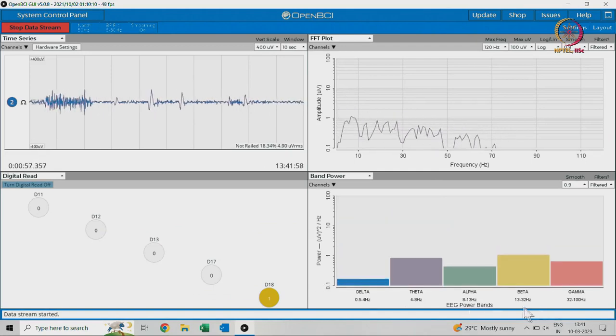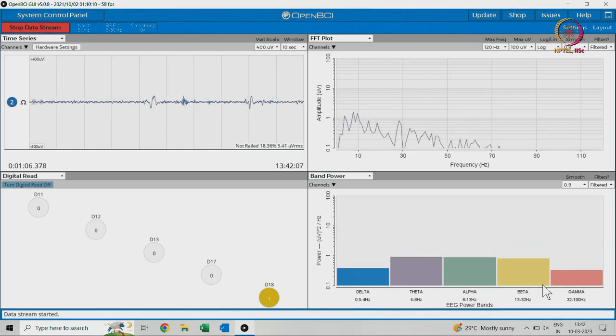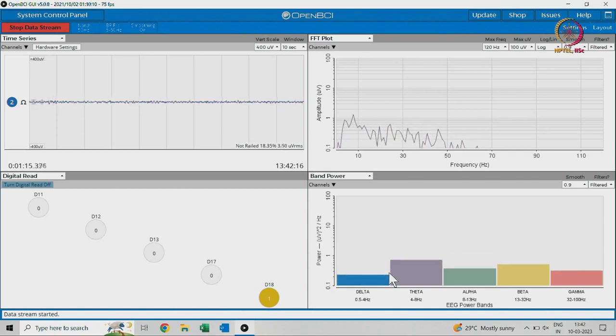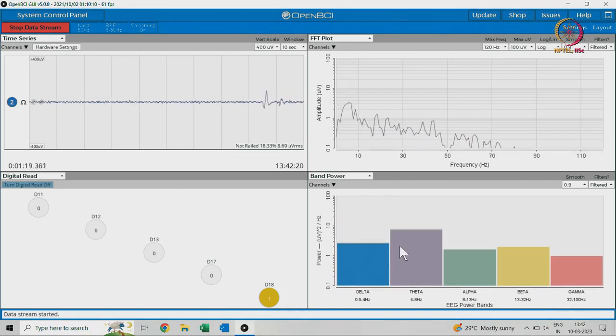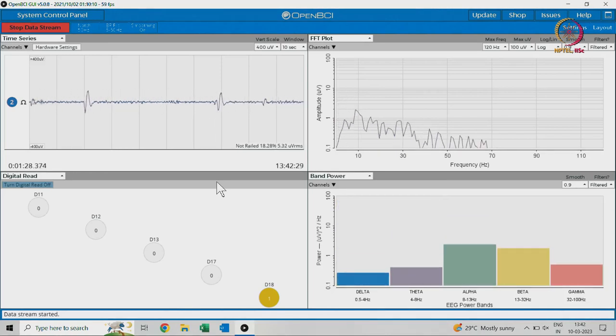When you are about to sleep or feeling drowsy, the low-frequency band will be higher. The same thing can be used for sleep staging or sleep quality measurement. Also, the same thing can be used to check drowsiness; there are more widgets to identify how focused or relaxed you are. If you have proper electrode placement and a proper experimental protocol, you can explore and leverage several applications. This was a brief demonstration of how biopotentials are recorded, how they can be monitored, and how they can be interpreted.